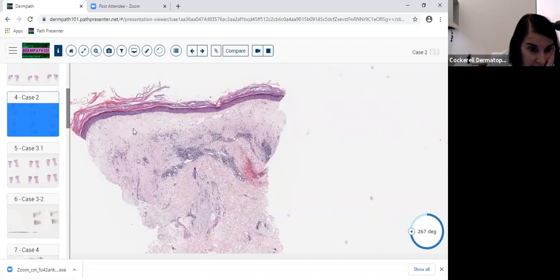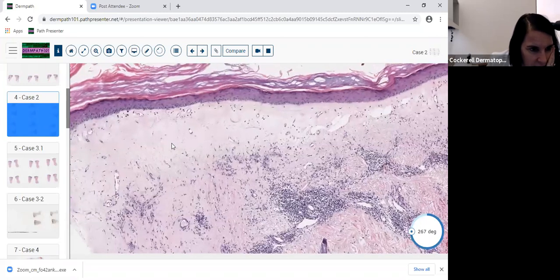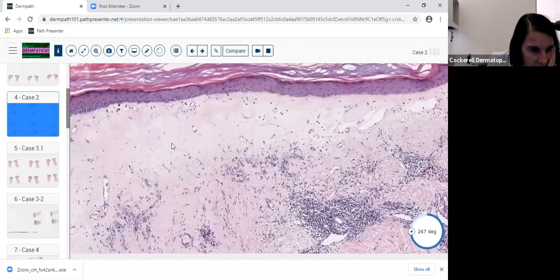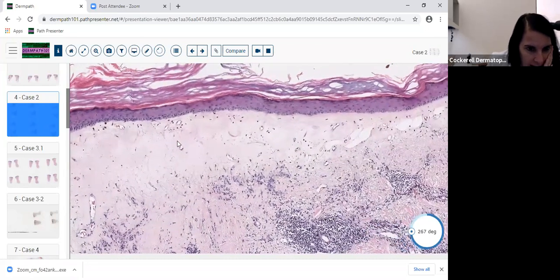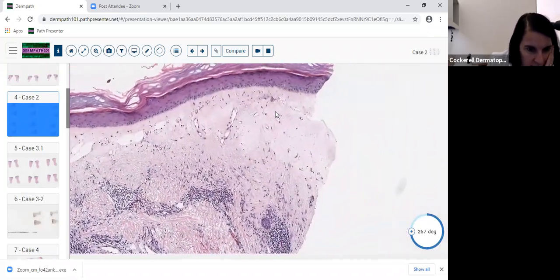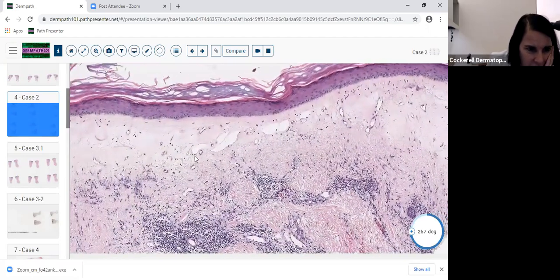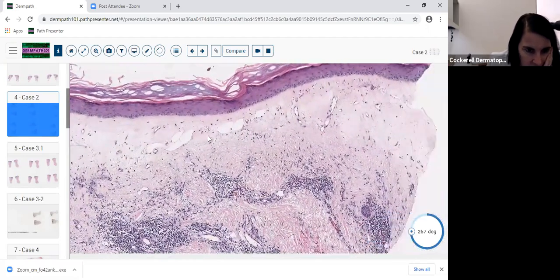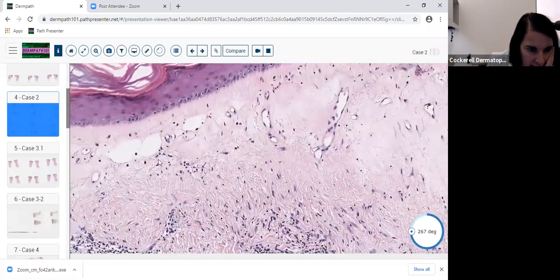Could this be amyloid? No, it doesn't look like amyloid. It's very pale looking, very, very pale, and homogenization of the collagen is going on. The reti are wiped out. So you're not thinking about some kind of macular amyloid or other amyloid, more nodular amyloid. When you see nodular amyloid, you actually see the nodules of the amyloid, and you're not seeing that here. You're seeing some ectasia here. These are either some blood vessels here, and you're seeing some ectasia of these lymphatic vessels.